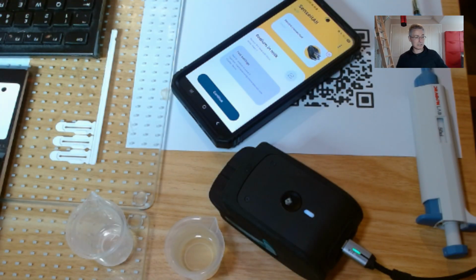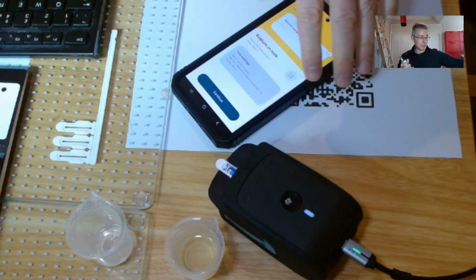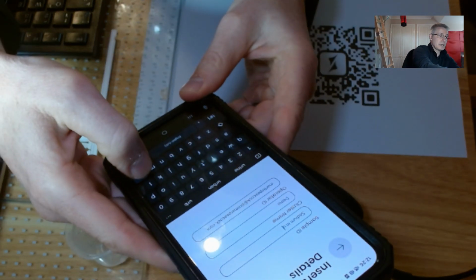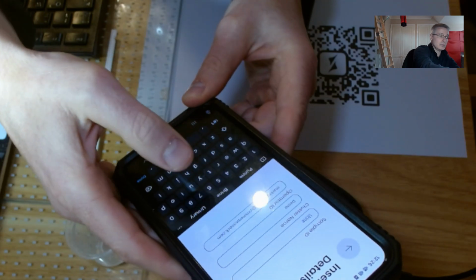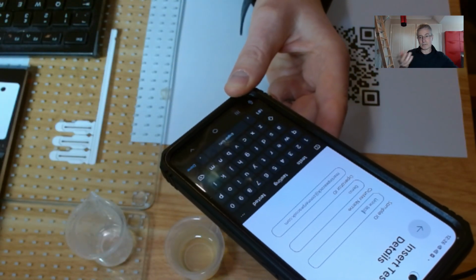Now I'll take the sensor, I will put that on like that. I will grab some urine. In fact, before I do that, I'm just going to name this. I'll just put urine test. Understand that the business model at ZP, as I say, is contract development, contract manufacturing.